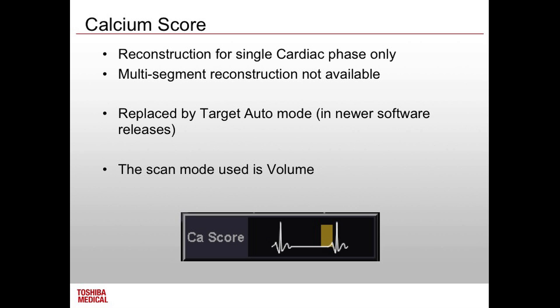Yeah. So what else, does anyone else know what affects Hounsfield units? One of your factors? kV. So ours are always scanned at 120. I don't think that's changed, but that'd be a good thing to check. I never used to do a calcium score at 135 kV because it would shift the Hounsfield units.